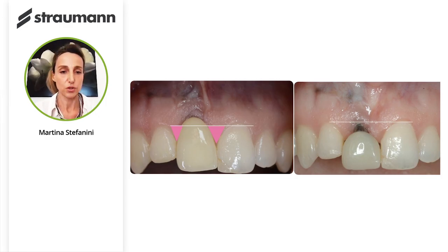If we want to position our connective tissue graft, which will be covered with the coronally advanced flap, at the level of the final ideal position of the mucosal margin, at the baseline you see that we have only 2 small triangular anatomical papillae that will remain coronal with respect to the ideal position of the connective tissue graft. And these 2 small anatomical papillae will not give enough vascular supply for the surgical papillae of the coronally advanced flap. So with the prosthetic pre-surgical phase, we are able to increase a lot these interproximal soft tissues.